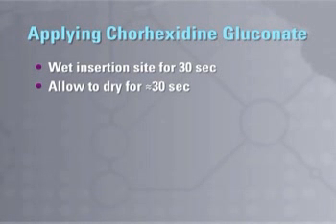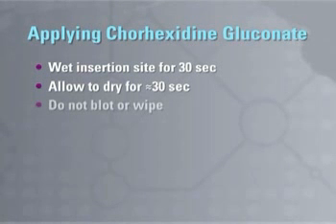Chlorhexidine gluconate has a persistent antimicrobial activity. It prevents regrowth of microorganisms on the skin for at least 48 hours. Completely wet the needle insertion site with strokes of chlorhexidine gluconate applicator for 30 seconds. Allow the area to air dry for approximately 30 seconds. Do not blot or wipe the area.